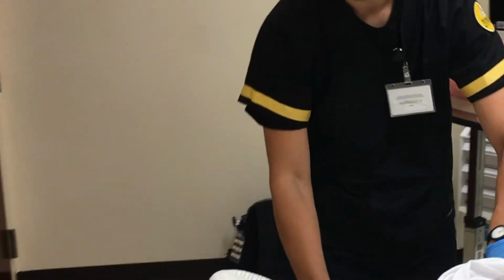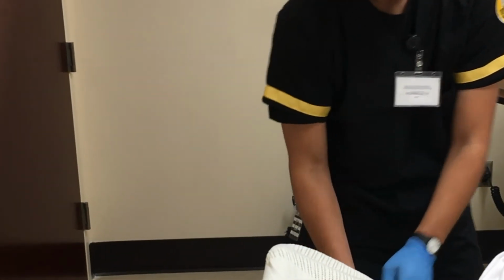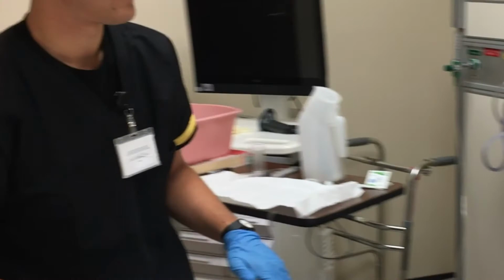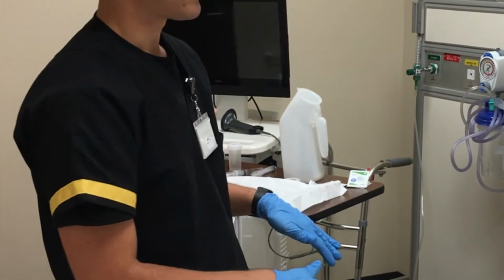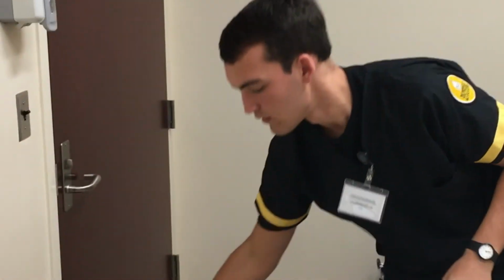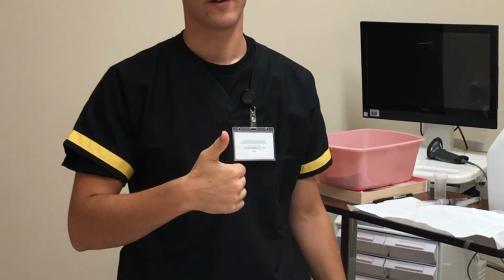But I have a urinal in your bathroom, so just let me know the next time you void, and I'm going to put the nurse call light by your bed, so you can call me, and I'll be there. Now I'm going to remove these gloves, wash my hands, and that's urinary catheter insertion.